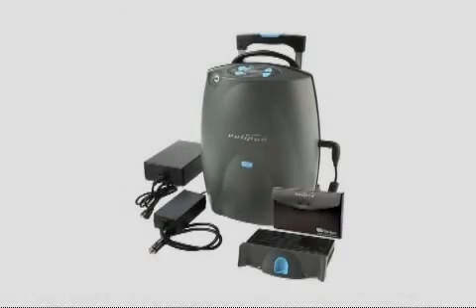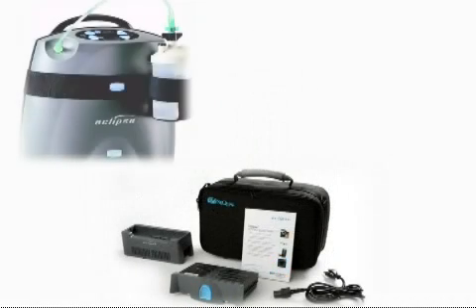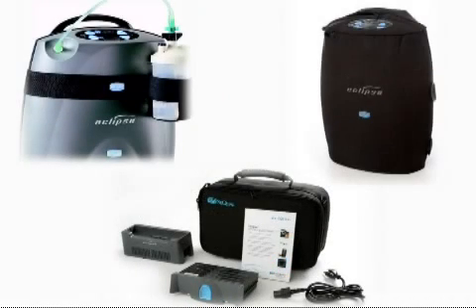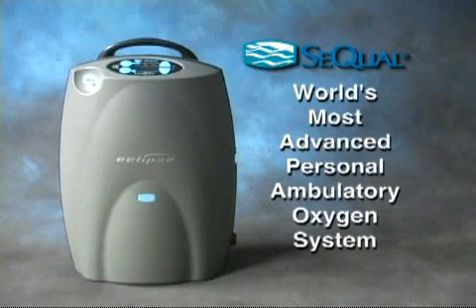The Eclipse II comes complete with everything you see here. And to help you get even more benefit from your Eclipse II, we also offer a wide variety of helpful accessories. Please ask your home care provider for more information on these accessories or visit sequal.com for details. We hope this video has been helpful, and we trust that the Eclipse II will offer you enhanced freedom to enjoy an active, fulfilling life.